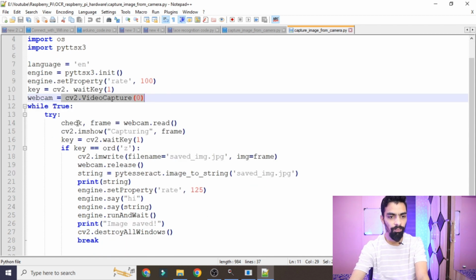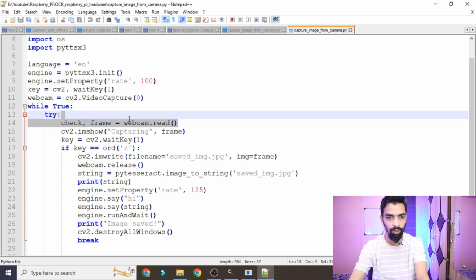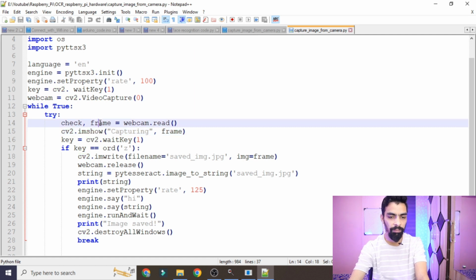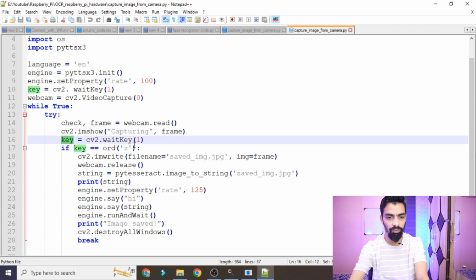Then while True, the next part is check web frame. Whatever the camera is capturing right now, the live image, is captured by this line, and it is shown in frame format here. Then cv2.imshow: whatever the camera is capturing, we have to show on the screen, so this is the line to show that image. Then we are waiting for the key from the keyboard.